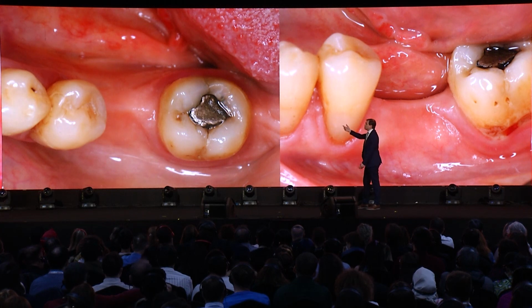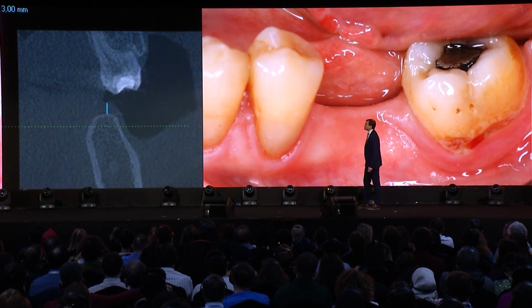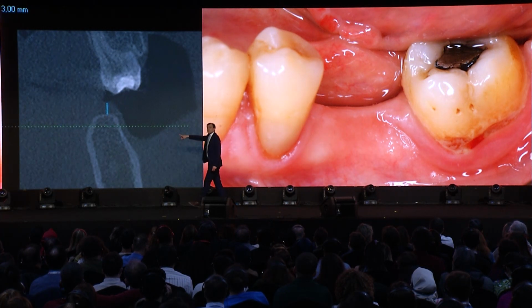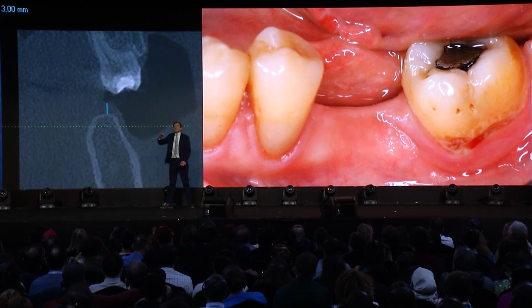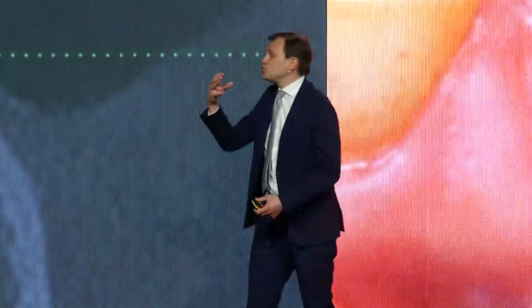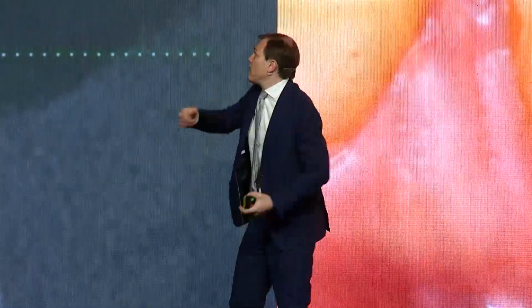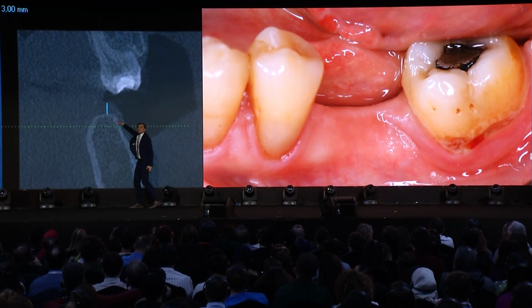Now, just to illustrate the clinical situation, this is how we measure tissue thickness, and this is how I recommend to do it. Not intraorally, but when you do a CBCT scan, put a lip retractor on the patient so that the cheeks and tongue are distracted from the jaws, and that's why you can clearly measure tissue thickness vertically.